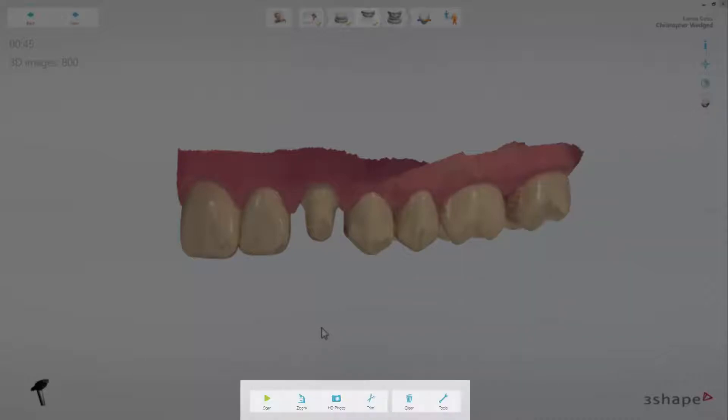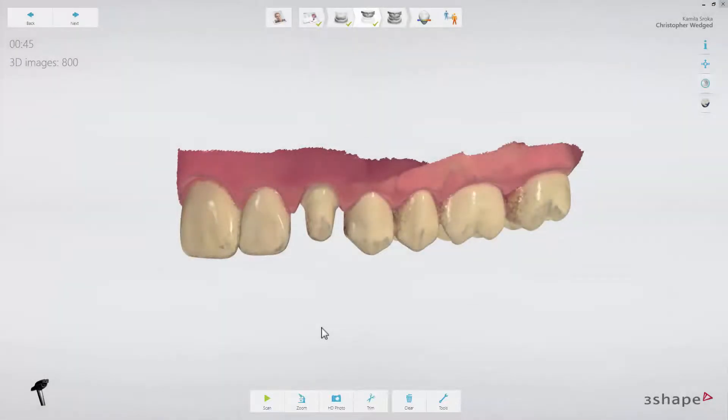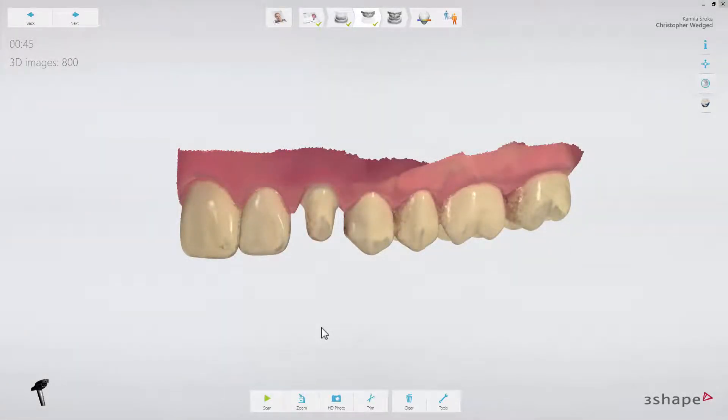At the bottom of the screen, you can find the toolbar containing general scanning tools. The first button is to start and stop the scanner. This can also be done by pressing the scan button on the scanner itself.